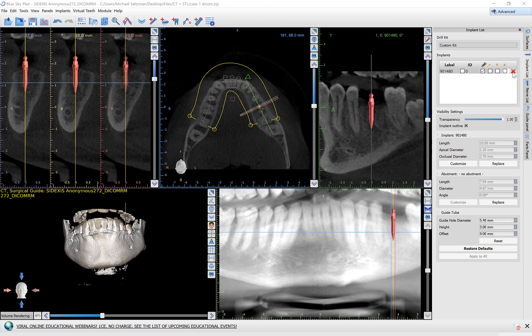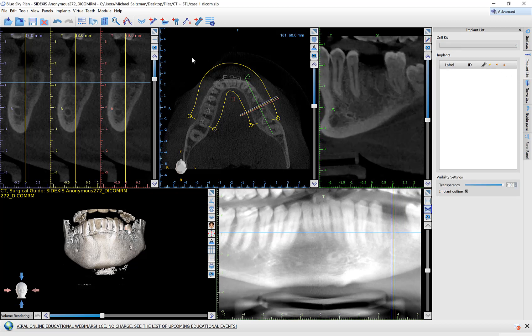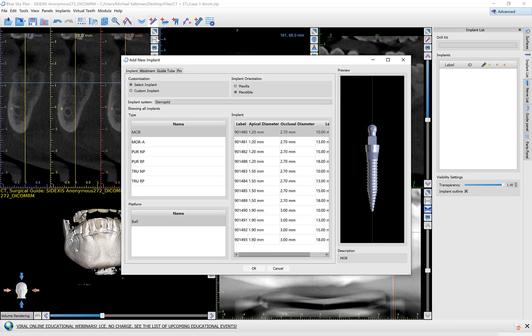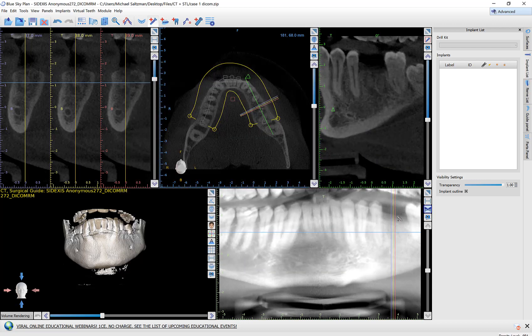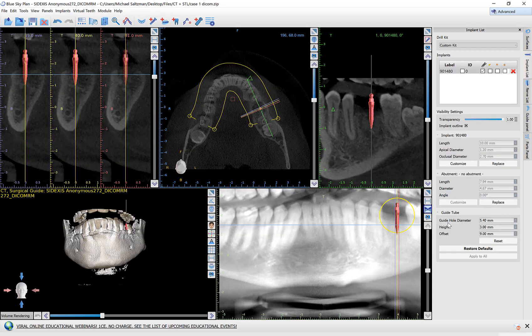So now what I expect is: if I delete this implant and then place it again, the guide hole diameter, instead of being 5.3 as it was previously, is going to be 5.4 since I've selected the custom kit option. So I'm going to delete this, place the same implant 901480 again — and I have the guide hole diameter being 5.4. I can do this for as many implants as I like, and as long as I have custom kit selected, the next time I place the implant it will once again open the custom settings.